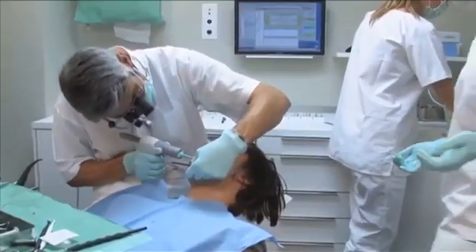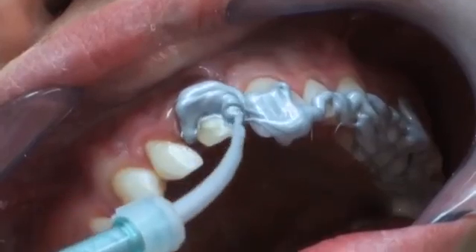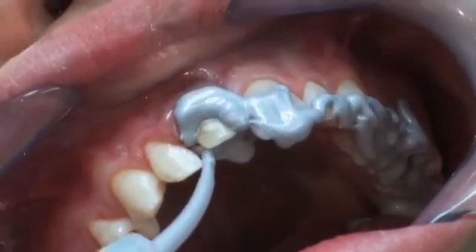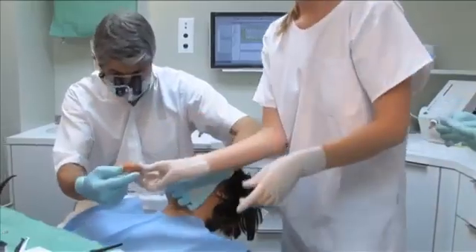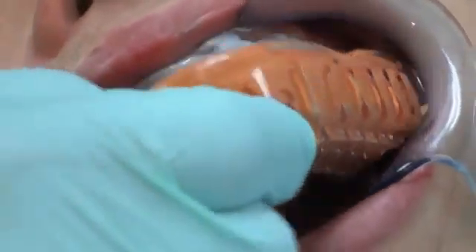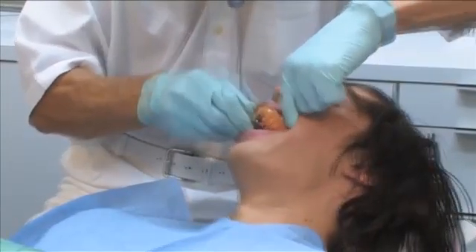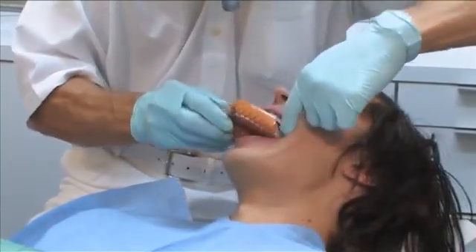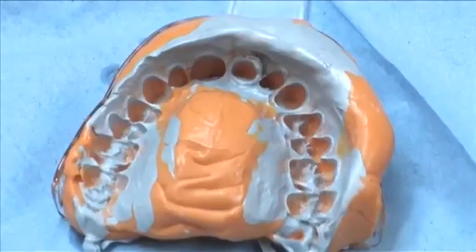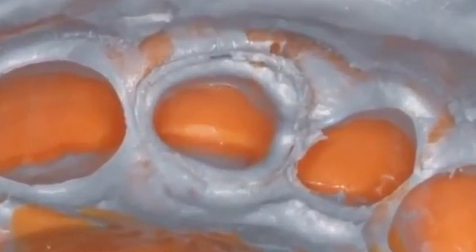Using the convenient micro-system dispenser, the wash material is easily applied directly into the mouth. Filling of the tray and syringing the wash material should be completed simultaneously. The one-step putty wash impression is performed using a Finnis heavy body and a Finnis precious light body. This precision impression material distinguishes itself by its easy readability of detail, thanks to its silver pigmentation.